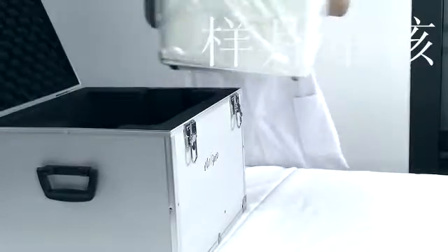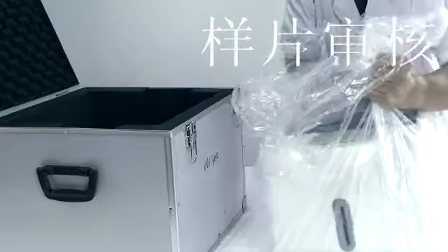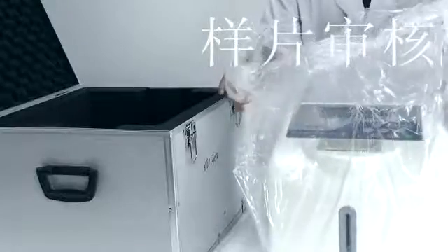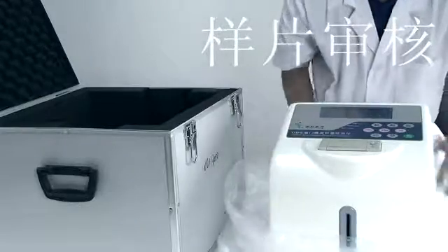Move the device to the installation platform. Check whether the device was damaged during transportation. Check the accessories according to the instruction manual, and make sure all documentation and accessories are complete and in good condition.